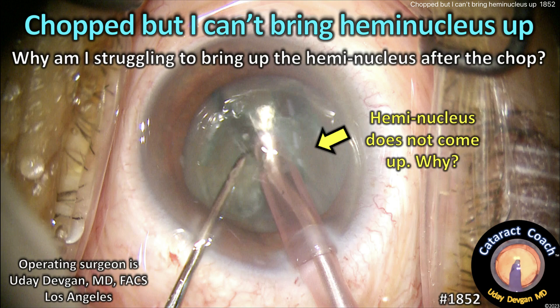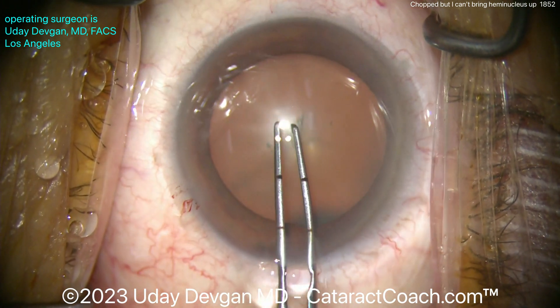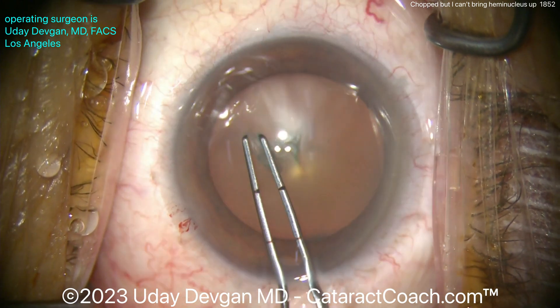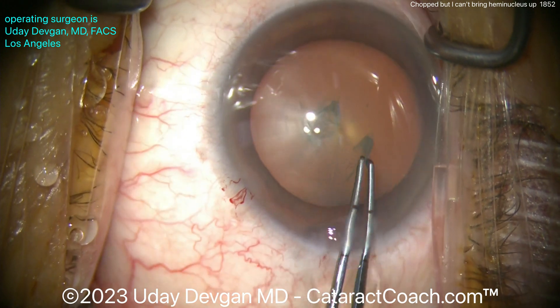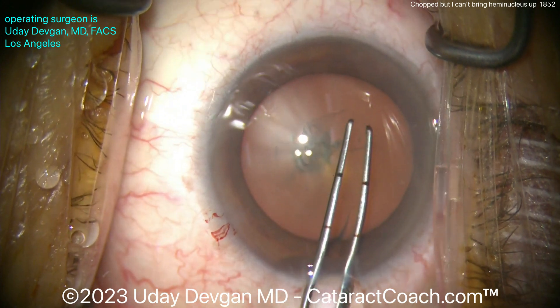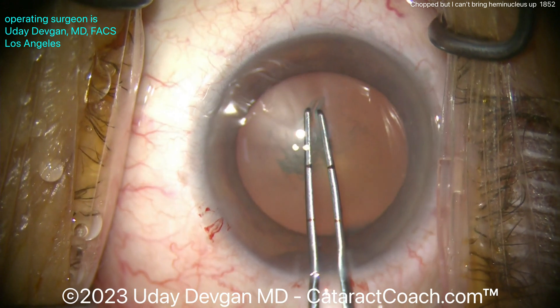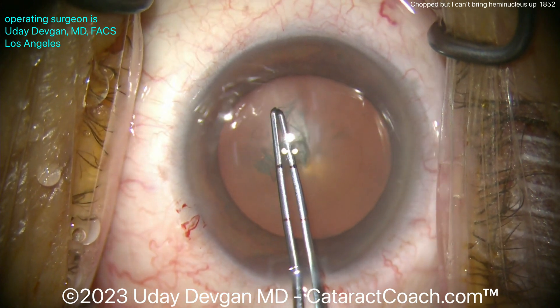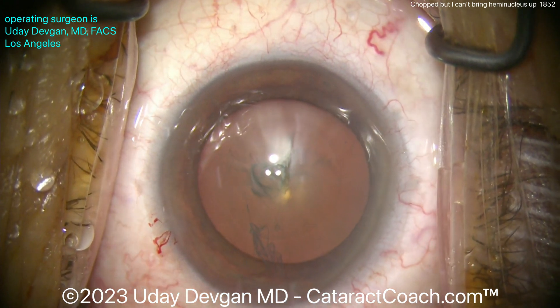CataractCoach.com. I chopped it but I can't bring the hemi nucleus up — why am I struggling to bring up this hemi nucleus after a phaco chop? Let me show you the case. I'm going to start off with the rhexis; obviously the incision's already been done. We're going to get a nice normal rhexis, so the issue is not a baby rhexis or anything of that nature. We'll get a nice five millimeter rhexis. We'll get good hydrodissection, but you'll see I'm going to have a little struggle — I'm going to try to chop that nucleus and it looks like a pretty good chop, but I won't be able to easily bring up a hemi nucleus. Let me show you what we do to address that and how we resolve it.